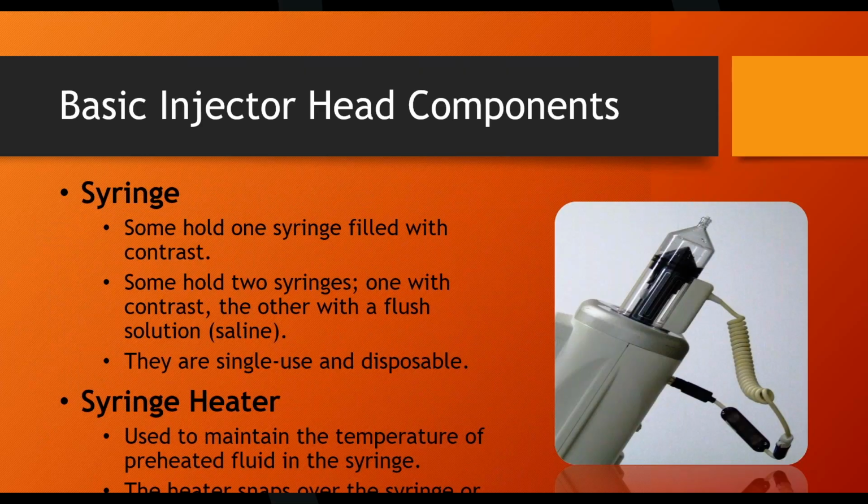Because on the first shot with no saline, or with just saline, all the blood vessels were black. With contrast, they were all light. Whereas all the soft tissue around it stayed the same for both shots. So if you ever see one of those 3D images of just blood vessels, that's how they do that. That's one of the uses of the saline. There's a few others, but yep.